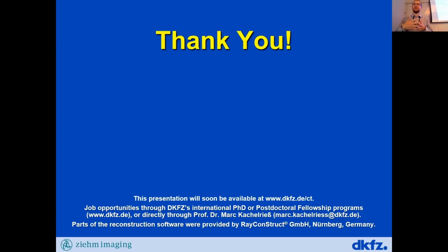From 2 update views, I should say, and there we also use the 2 views from the previous time step. So we use temporal information there because using just 2 projections and no temporal information, there's too much ambiguity in the position of the tools. There we found that using this temporal information is necessary.